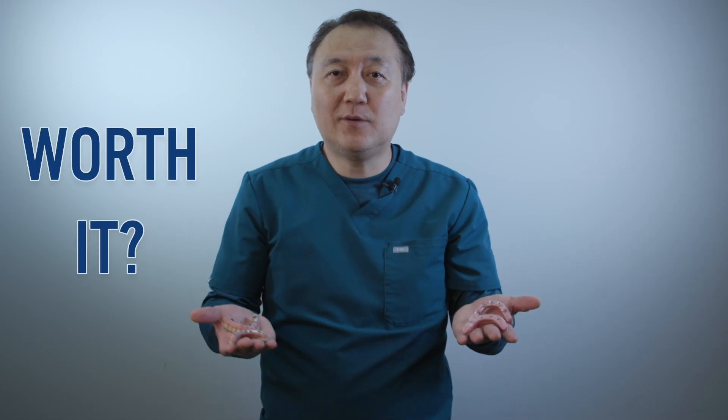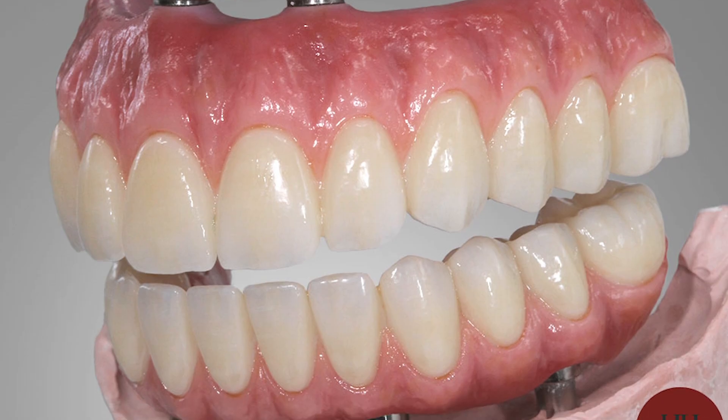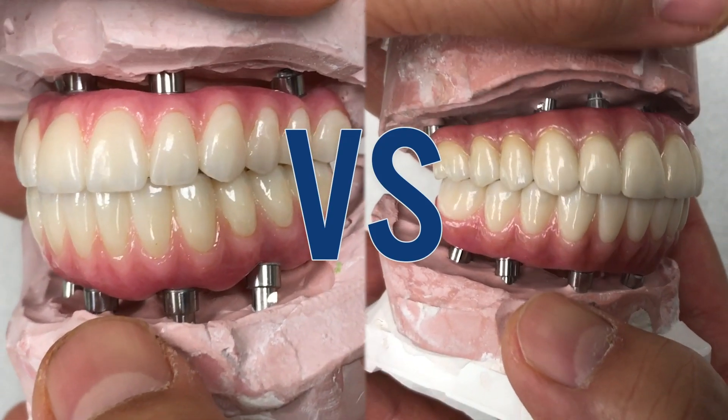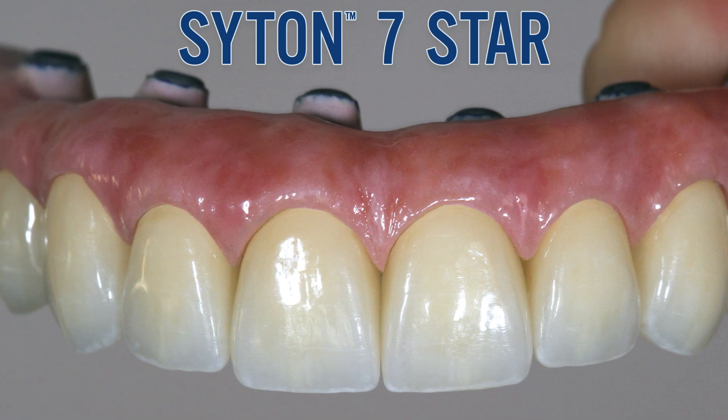Today's topic is worth it or not worth it — screw-retain zirconia. Our top-of-the-line product, Syton 7 Star, is coming up.